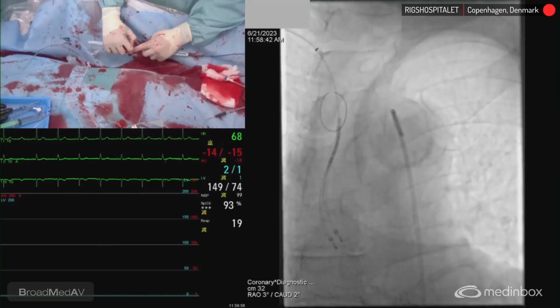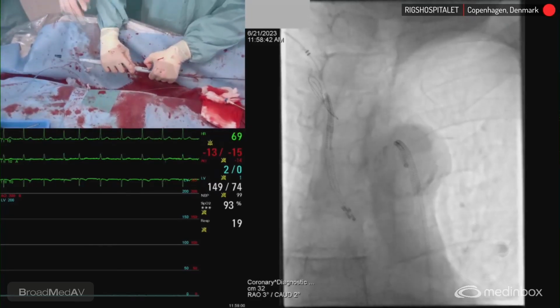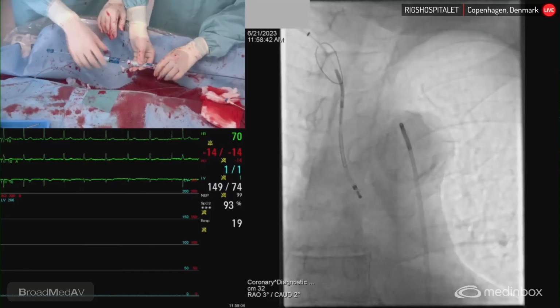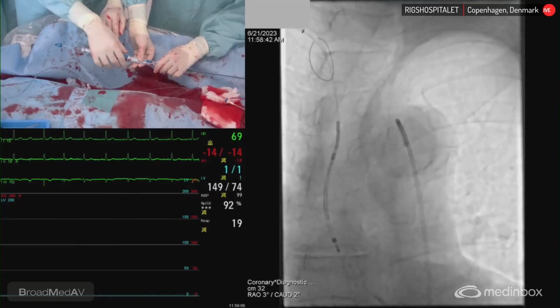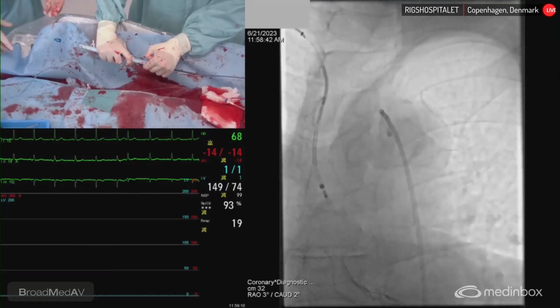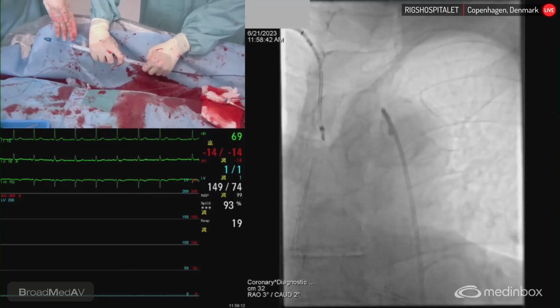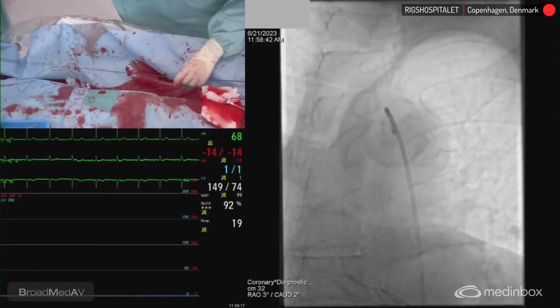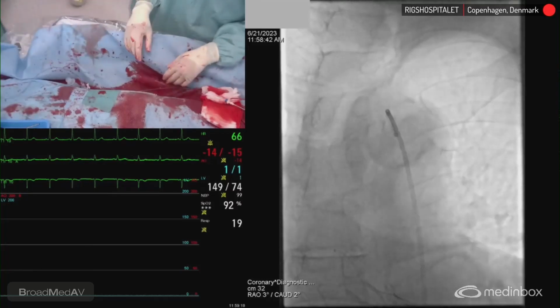No. Be careful, don't go too deep. Wait. Oh, no. This is not correct. We have to approach this, otherwise you will make a mistake. Yeah. Right. It's completely at the end. Yeah. All right, that's fine.